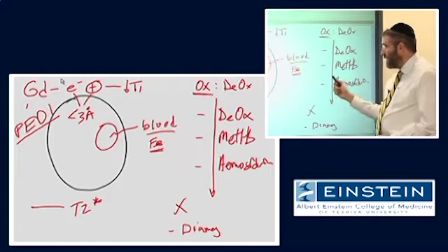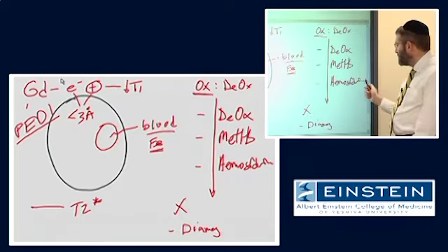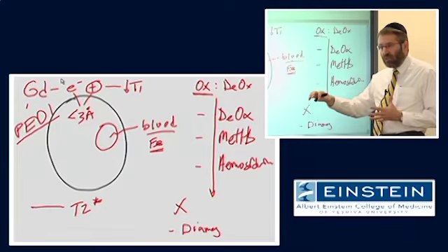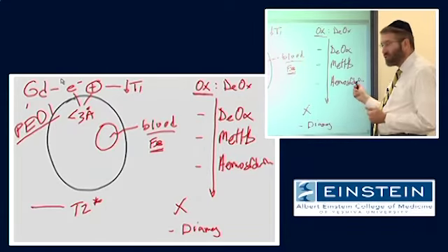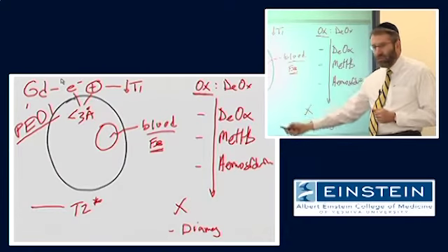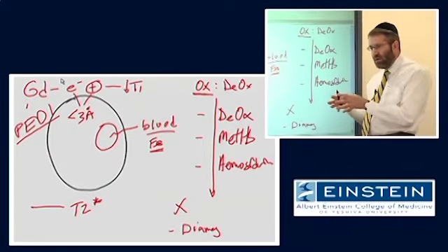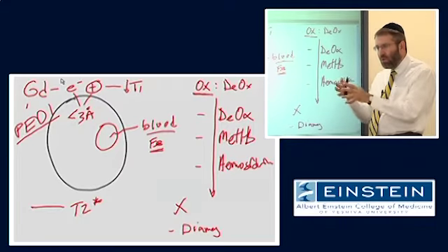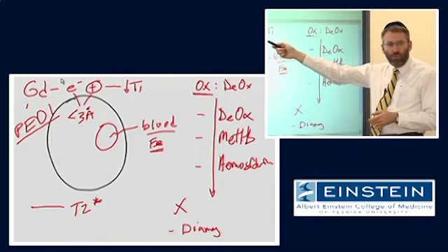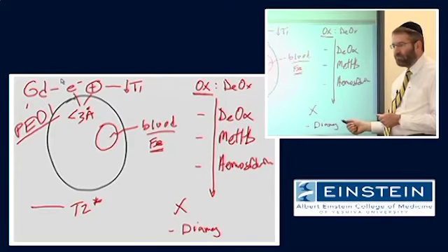The same thing is true in the case of hemosiderin for a slightly different reason. Hemosiderin is also a molecule containing many, many iron atoms, and as a result it is extremely paramagnetic and causes the most dramatic signal loss when we look at our T2 star weighted images. But again, because of the way the iron is organized in the core of this hemosiderin molecule, there's no access for water protons to get close enough, and as a result we don't see that effect.